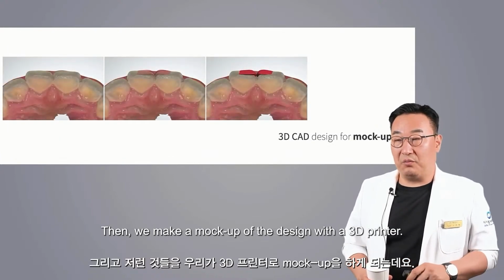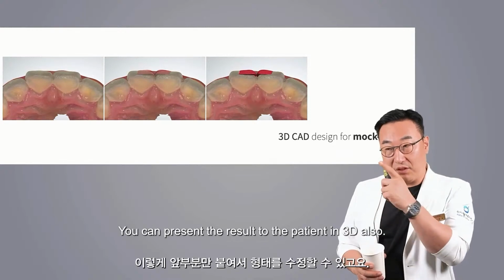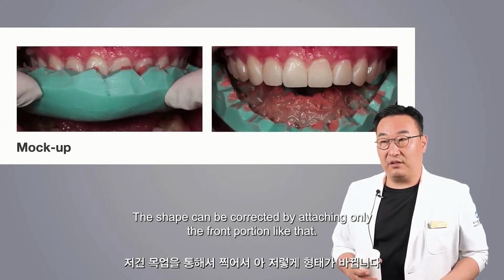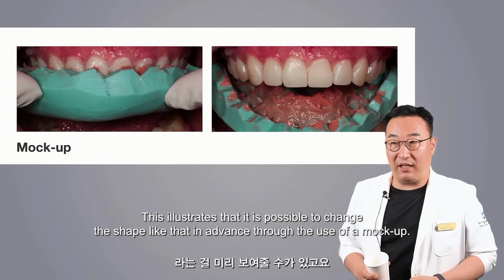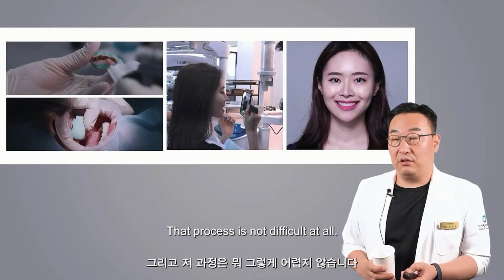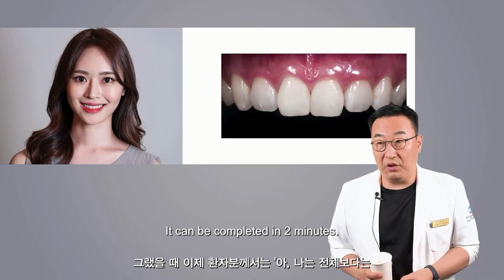Then, we make a mock-up of the design with a 3D printer. You can present the result to the patient in 3D also. The shape can be corrected by attaching only the front portion like that. This illustrates that it is possible to change the shape like that in advance through the use of a mock-up. That process is not difficult at all. It can be completed in 2 minutes.